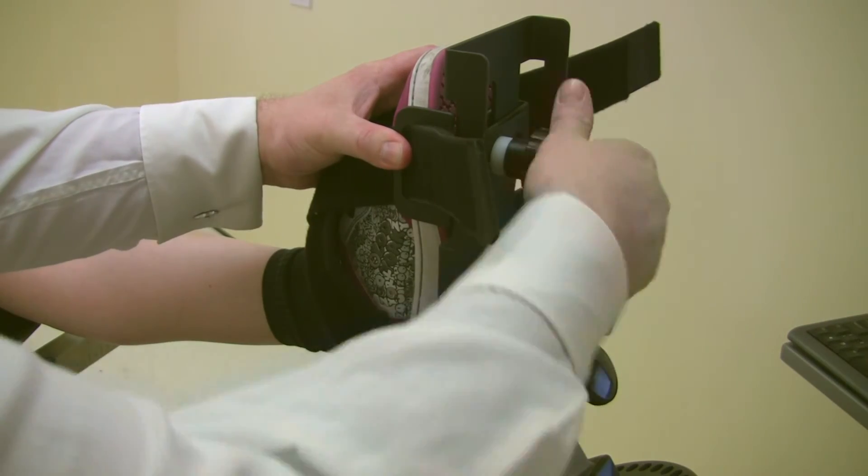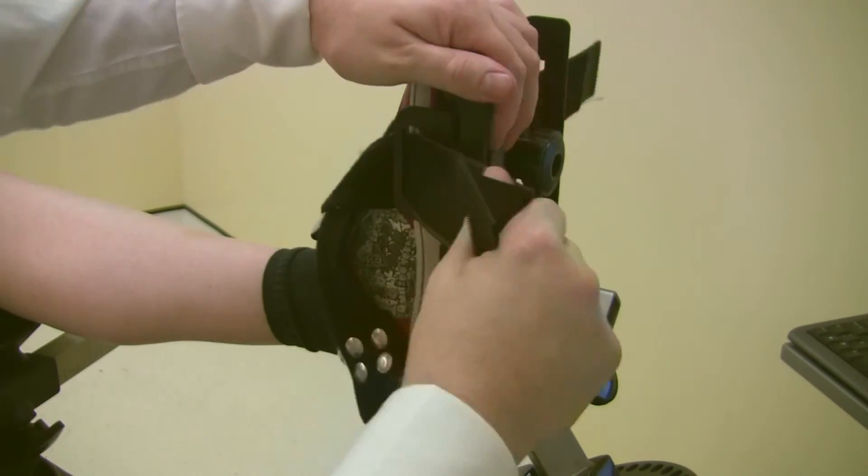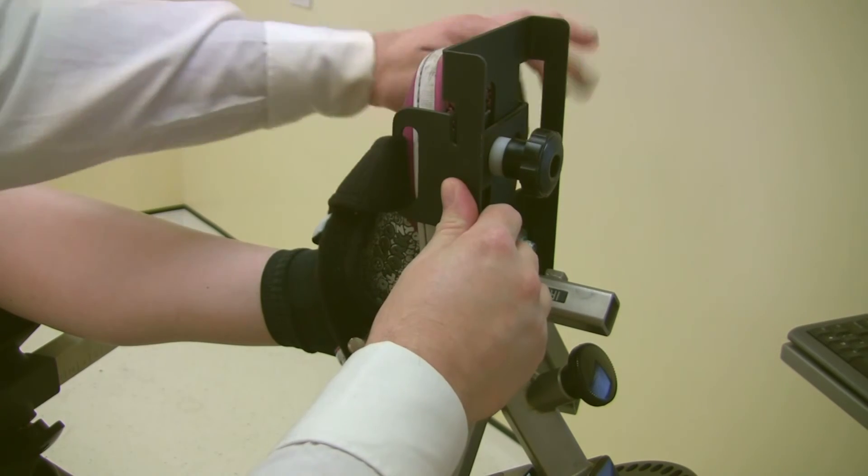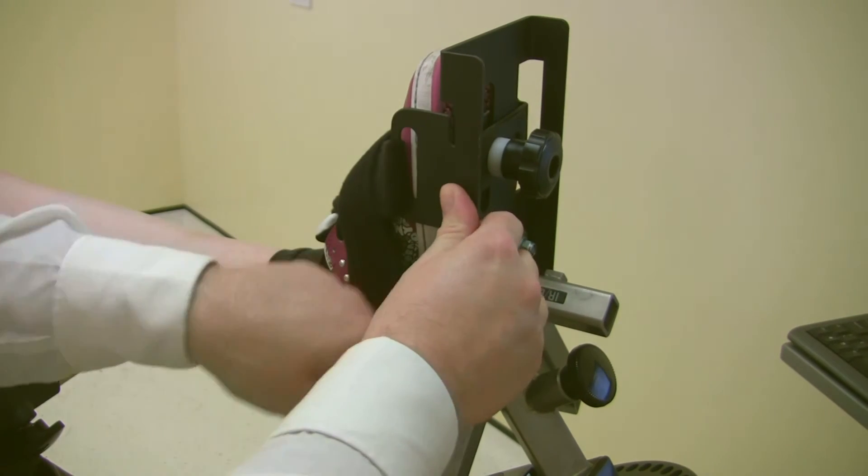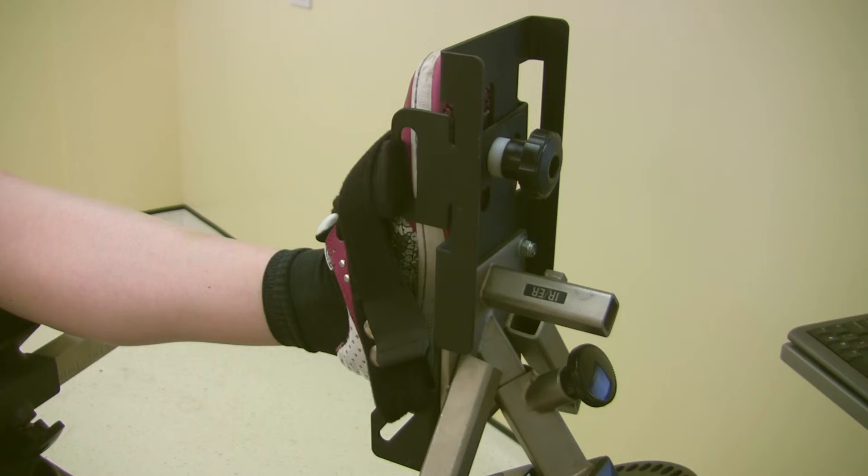Make sure they are firmly pressed into the foot, then lock in place using the screw. Finally, tighten the straps, making sure to tighten the uppermost strap first.